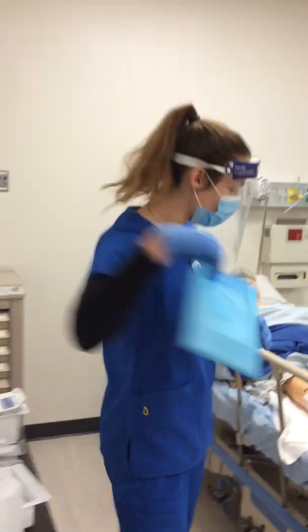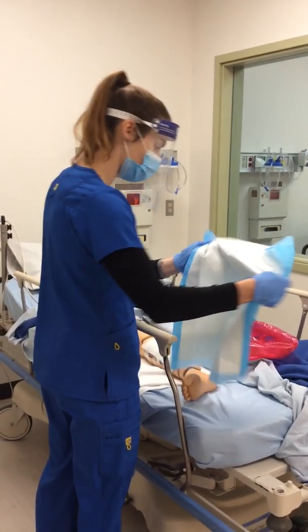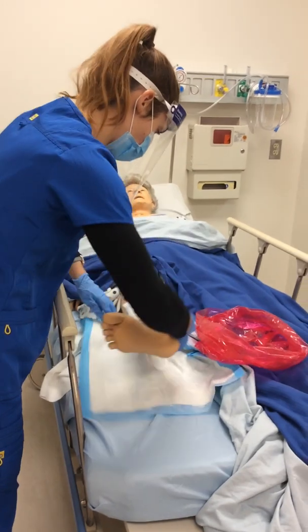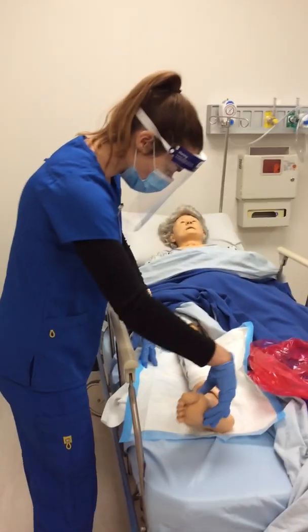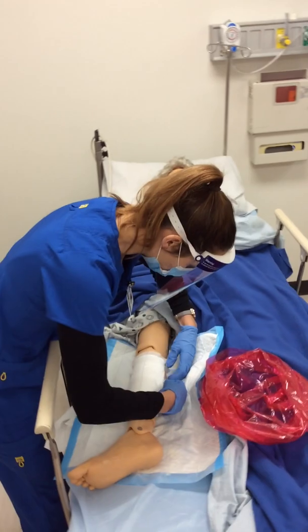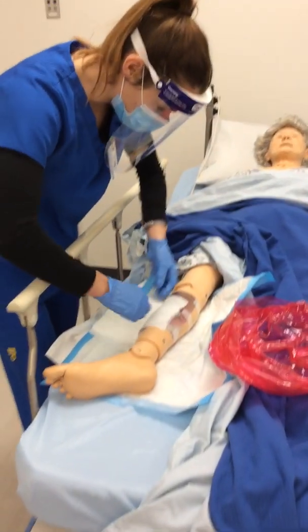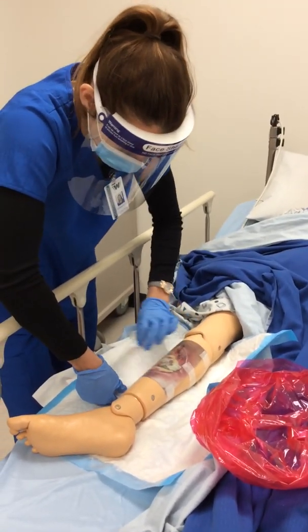All right, Shirley, can I have you lift your leg up so we can put this pad underneath to protect your bedding? Thank you. All right. So the bandage looks good from here. We're going to remove it. Take a look at underneath. It's extra sticky tape, Shirley. Good thing you've got healthy skin along the sides of your wound.